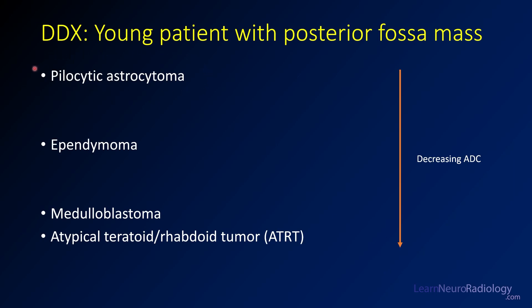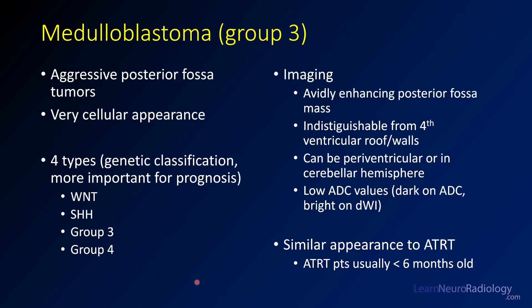Pilocytic astrocytomas are the most diffusion permissive, whereas medulloblastomas and ATRTs are the most diffusion restricting. This was a case of medulloblastoma. There are four types of medulloblastomas, with papers describing how to differentiate them based on location and prognosis — you don't need to know too much about this other than that these subtypes exist. These tumors are very aggressive posterior fossa tumors, very cellular, with reduced diffusion. Many times you're going to see them arising from the fourth ventricular roof or walls.